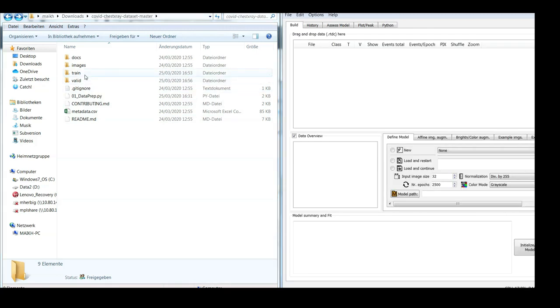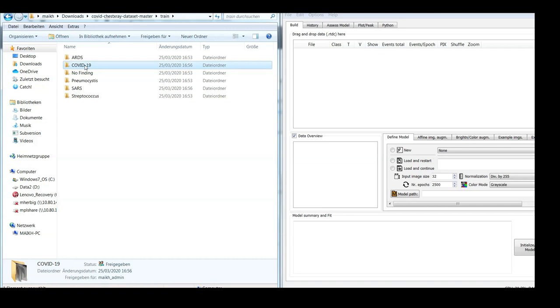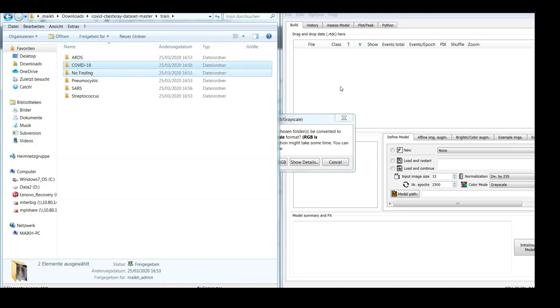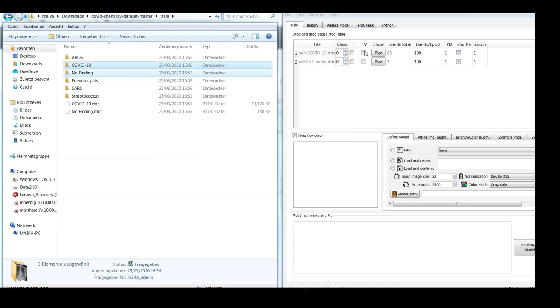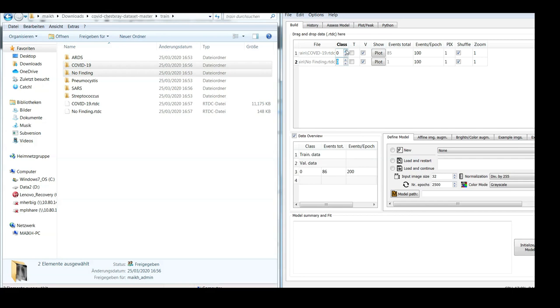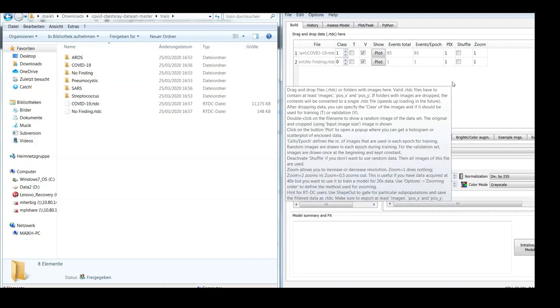So as I said, step number one is to check which classes the model would predict given this data here. So I insert COVID-19, and maybe also 'no finding.' And 'no finding' is class 0, COVID-19, let's say it's class 1 because it's more similar to pneumonia. And we don't want to shuffle but use all the available images.